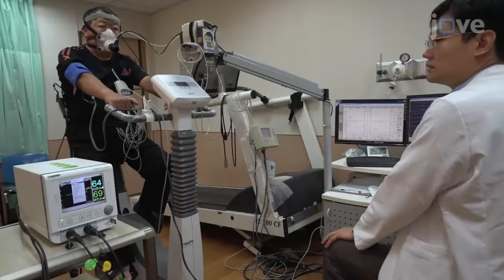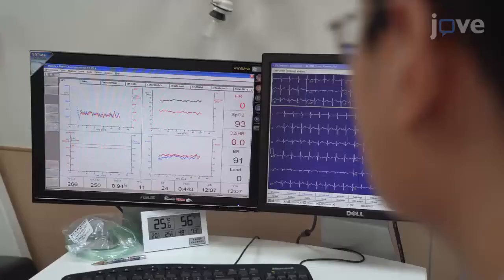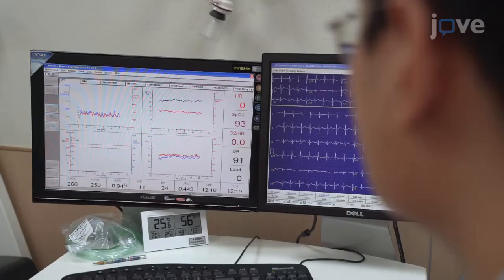First, tell the patient to rest for at least two minutes to obtain a stable baseline value, including the cerebral tissue oxygen saturation and respiratory exchange ratio. Next, have the patient complete the warm-up stage on the cycle ergometer at a work rate of 10 watts for one minute.